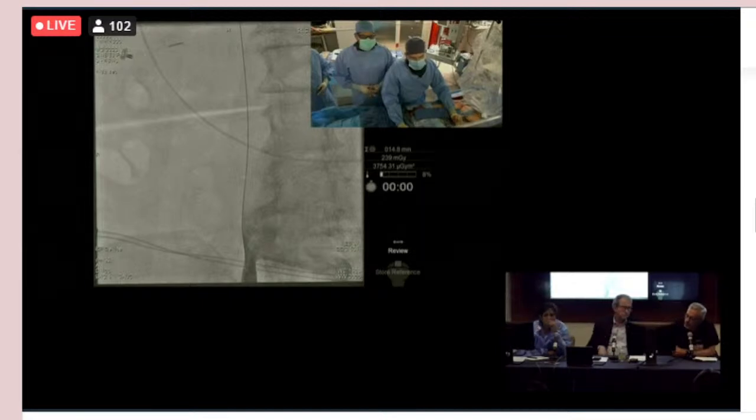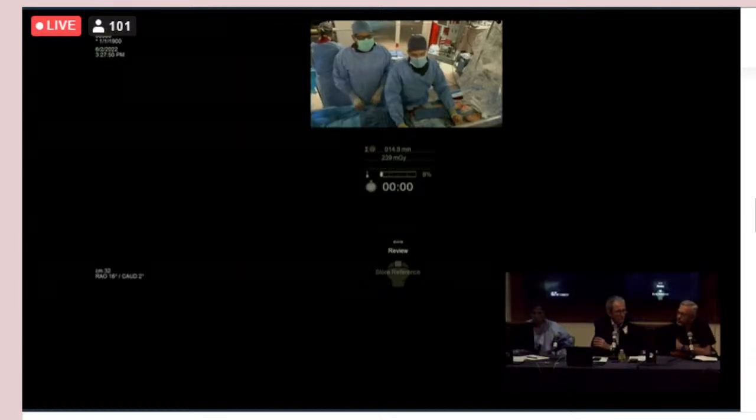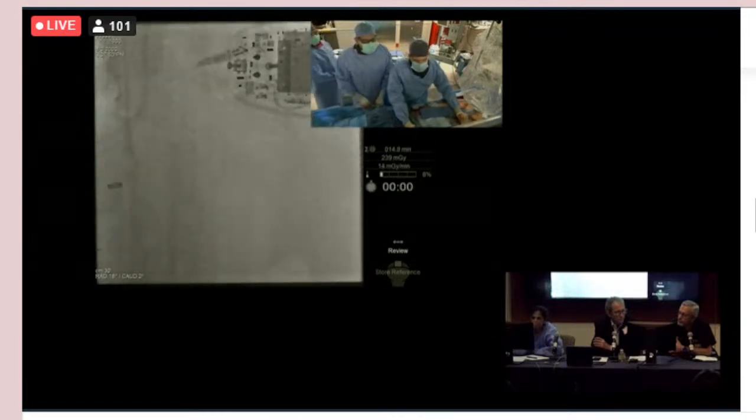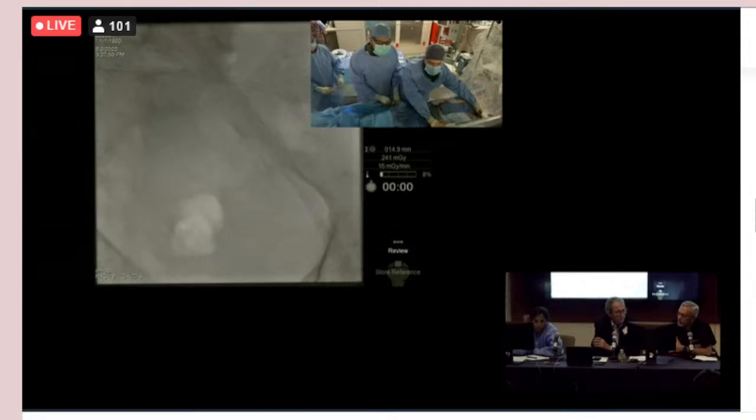This is from the femoral vein, correct? Yeah, from the right femoral. So we ended up going to the left side. Got it. And right now, because of her obesity, we're having a little challenge getting communication with the device. Note to self. Where are you now with things? Show us. So we went through the left femoral. We'll come down. There's the left femoral.